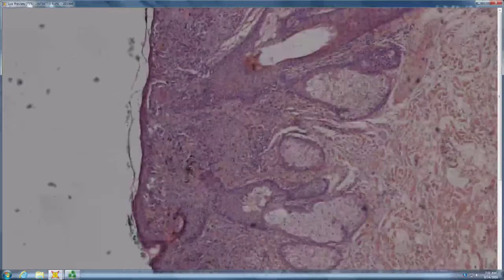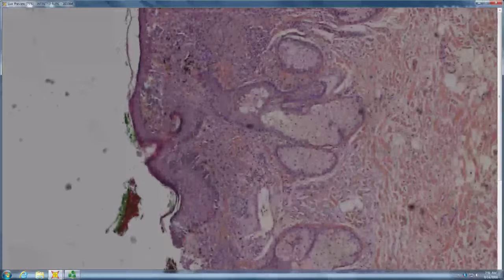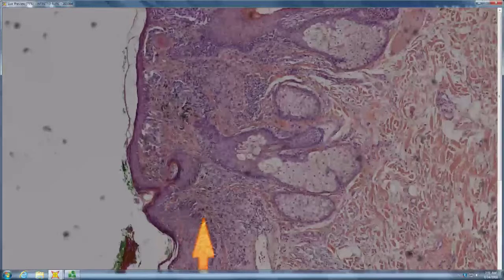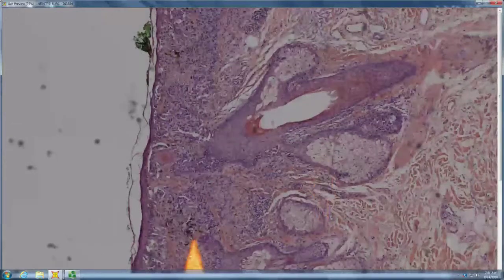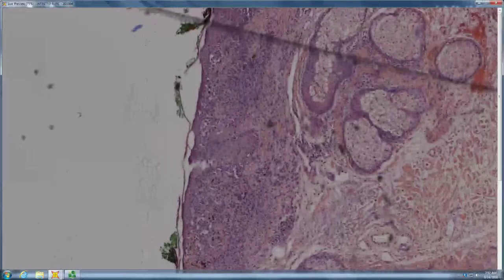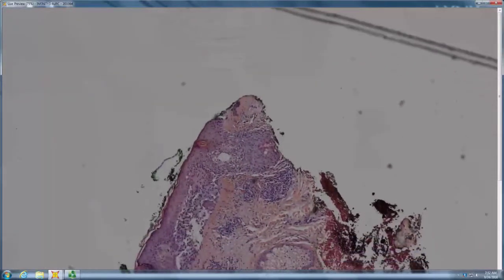It's melanocytic. I think about the melanoma you said. So I agree with melanoma in situ. It's melanocytic. It's poorly nested at the junction. You have areas where poorly nested units predominate over nests. It extends down adnexal structures. Nests are bizarre in shape. They're not regular in rhythm. They're not equidistant from one another. There are areas of confluence. There's zipper sign where, because you don't have desmosomes, the melanocytes separate from the underlying tissue. For all those reasons, yes, melanoma in situ.